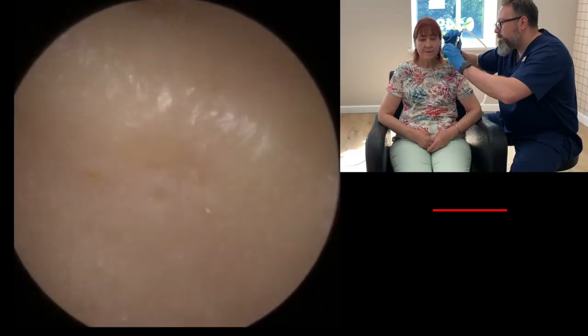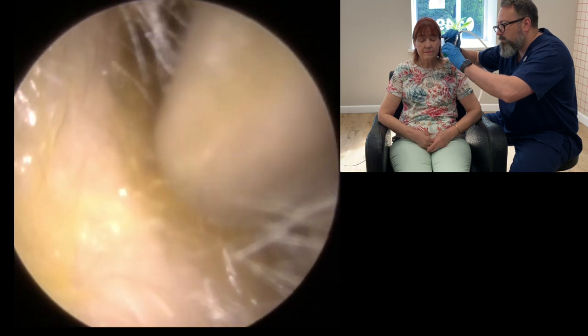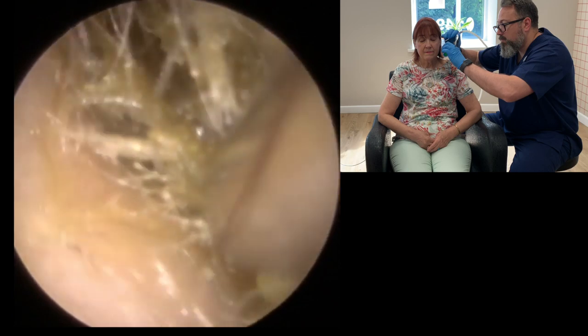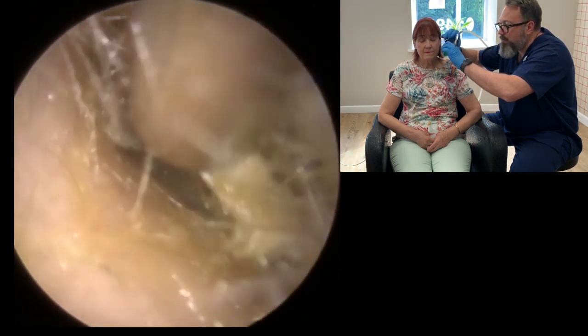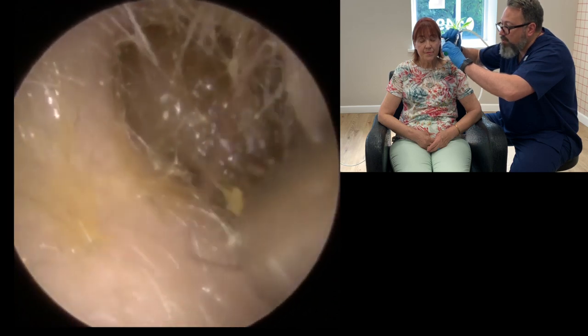So we're going to use the standard size Zolner tube today to start off with the suction. So what you'll see is we first go into the canal, just prepping everything ready. Just going into the canal, you can see we've got a very sticky bit of wax here at the entrance. So we're just going to get rid of that first and then slowly work our way along the canal wall, lifting the wax from the corner, wiggling it up and down. Because it is particularly sticky, we're going to use quite a bit of force to detach it from the canal walls, whilst also drawing it towards the outer part of the canal to help maneuver it towards the entrance.